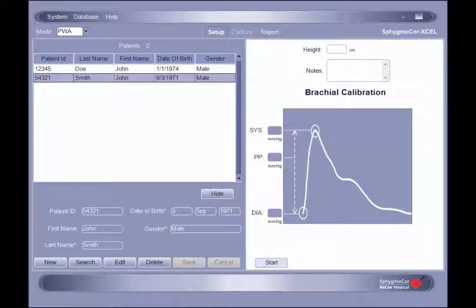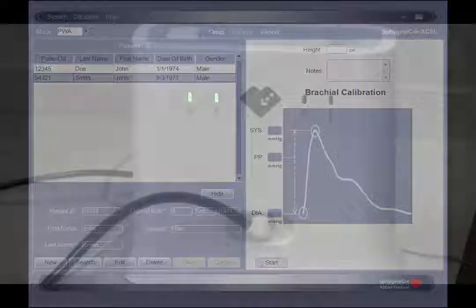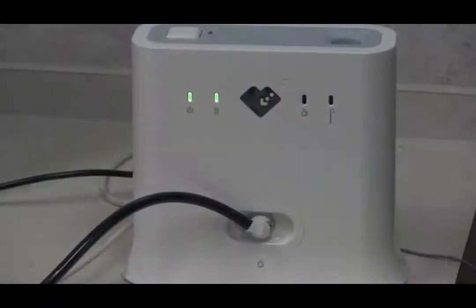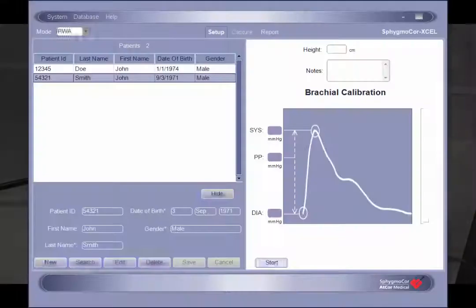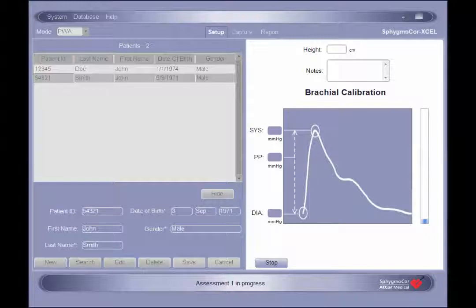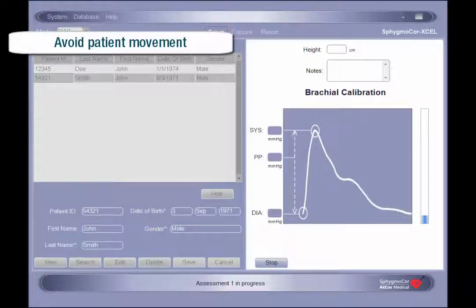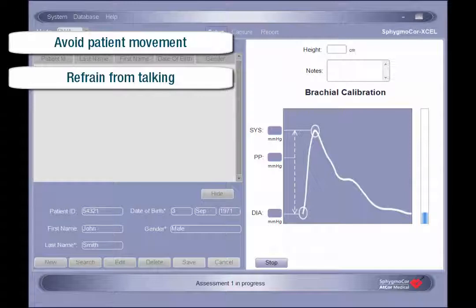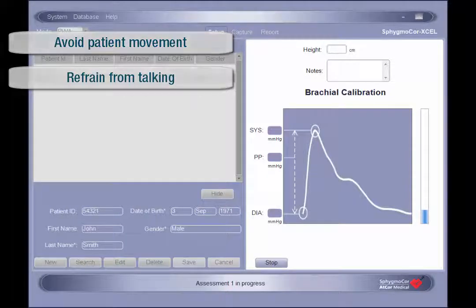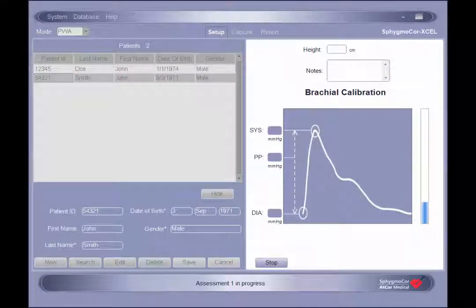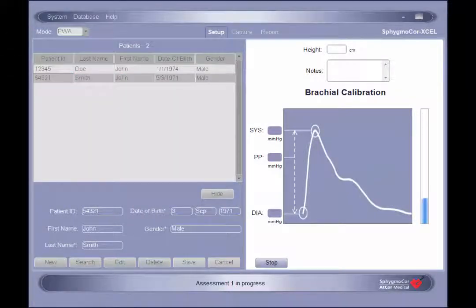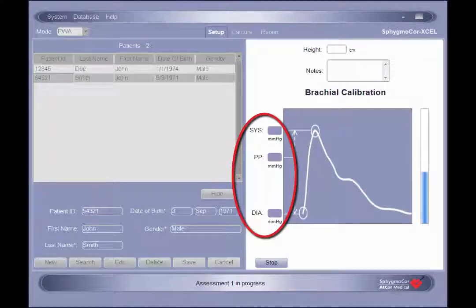To initiate the assessment, click the start button on screen. There will be an audible click as the pump turns on and begins to inflate the cuff. It is important to ensure that the patient does not move and both the patient and operator refrain from talking while the assessment is being performed. The SphigmaCore XL will automatically measure the patient's brachial systolic, diastolic, and pulse pressures.